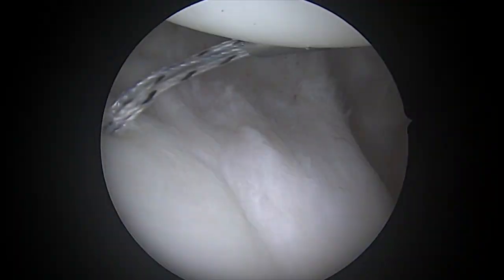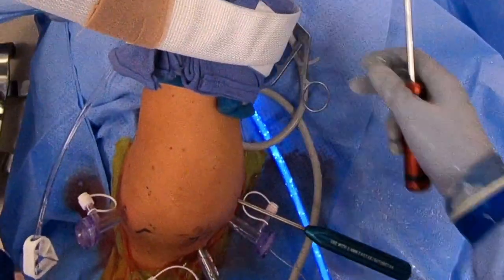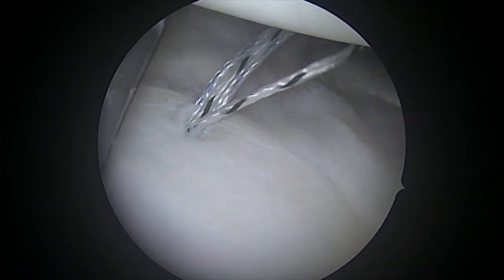Here's our look inside the joint. You can see how lax the capsule is. I've already placed an anchor here at the 5 o'clock position. One of the things you need to do before passing sutures is come in with a rasp and do a little bit of rasping of the capsule.